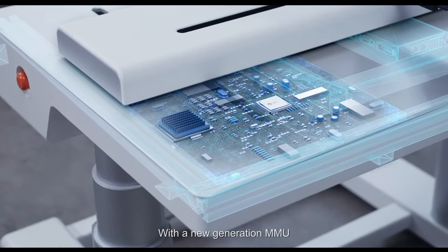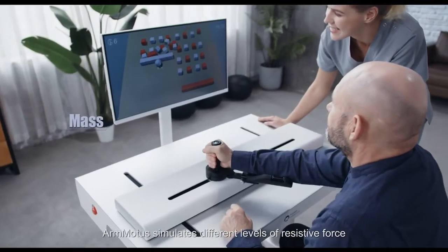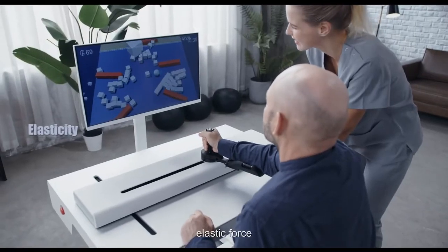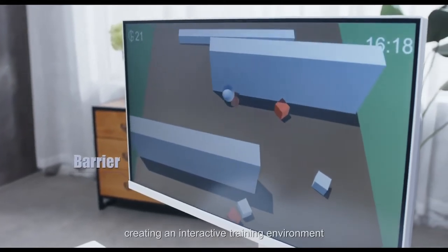With a new generation MMU, ArmMotus simulates different levels of resistive force, inertia, elastic force, and obstacles, creating an interactive training environment.